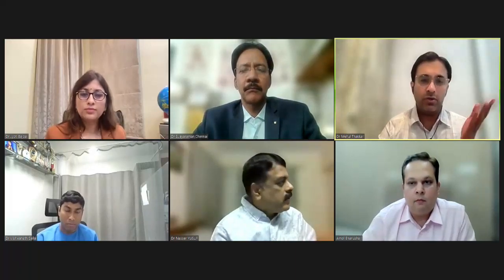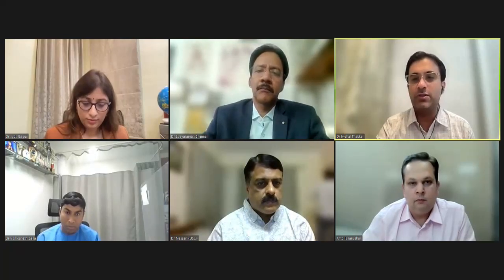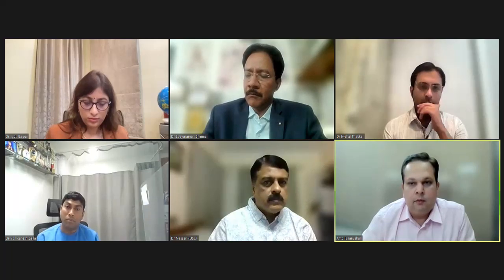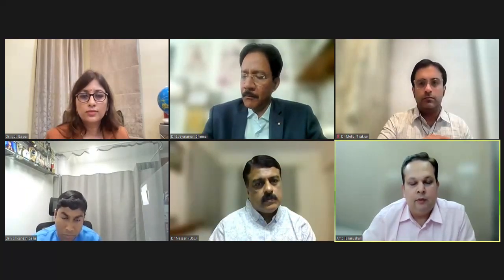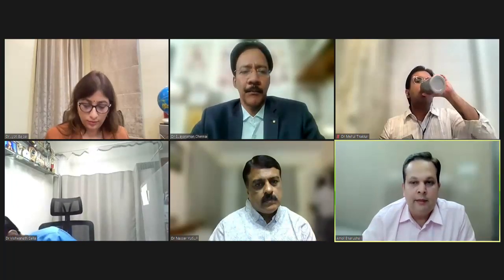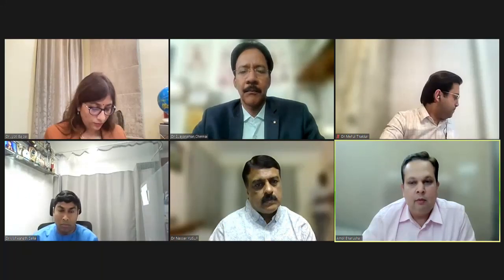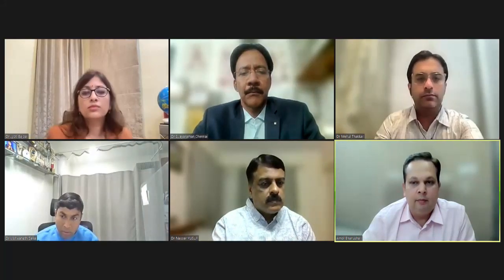And Dr. Amol, now I need to come to you only. What are the interventions the surgeon can offer in a case of a spontaneous pneumothorax, or a pneumothorax for that matter? So the first thing is, in primary spontaneous pneumothorax, when you have blebs or especially bullae, bullectomy with stapler, similar to the video Dr. Nasser showed. We now do most bullectomies by uniportal VATS. So we can do a VATS bullectomy.